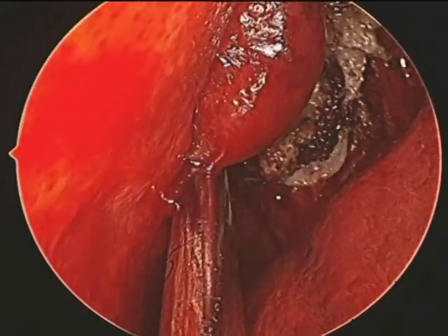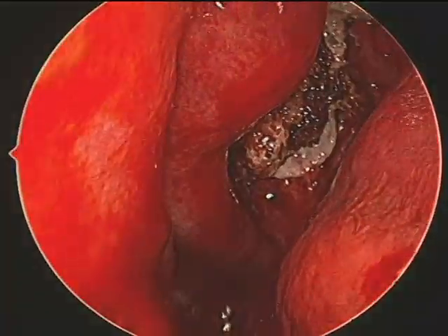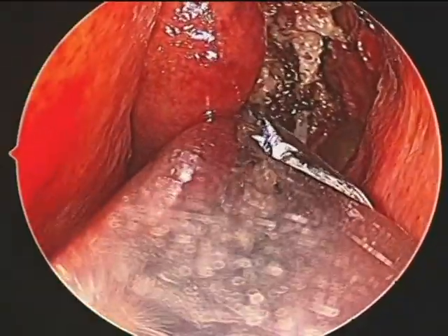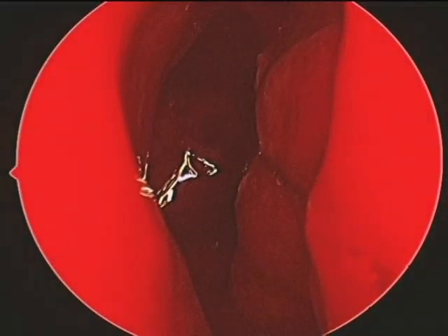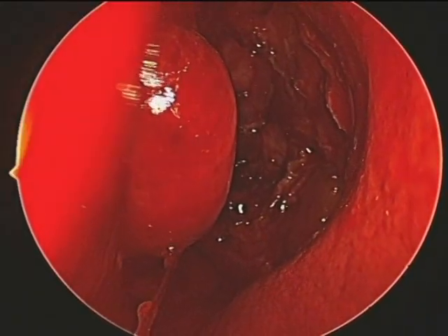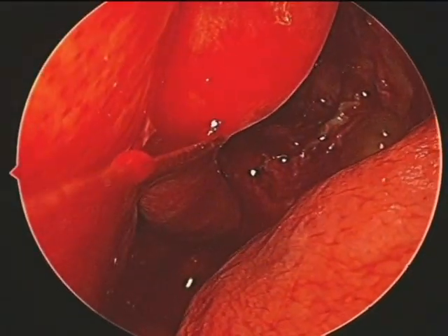Above all, medialization prevents potential lateralization of the middle turbinate, which would occlude the surgical cavity and lead to postoperative synechiae and recurrence of chronic rhinosinusitis. We now use a suture for medialization of the middle turbinate onto the septum. You can see the surgical cavity — the middle turbinates are medialized onto the septum, giving a clear view for postoperative decrusting and making follow-up pretty easy. We see the right nasal cavity, the right ethmoidal cavity.